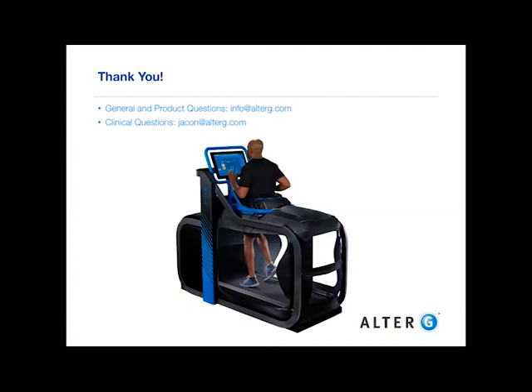I think, in therapy, the concern is always if you release a clot, where does it go, right? So again, that's up to the discussion with the physician. If the physician is okay with the patient exercising, they have no problems with them, then yeah, I think it's fine. But a lot of times with an active DVT, they may want the patient to rest, to wait for things to clear up before proceeding, even with simple rehab activities. So just check with the physician, make sure it's cleared. We always list that as a contraindication, just being safe, not wanting to release that clot and have it travel somewhere else in the body.